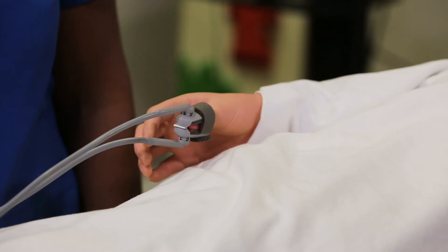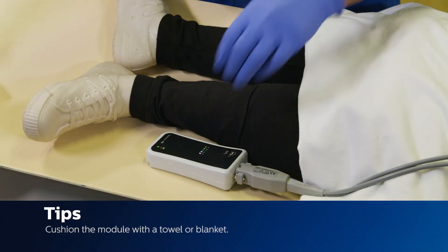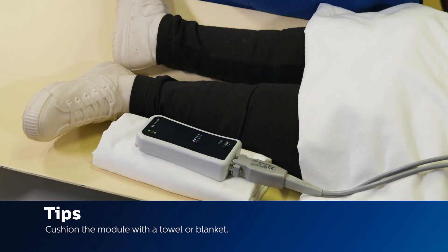To ensure SPO2 accuracy, make sure the probe is applied to the patient correctly. Tip: Place the module on a cushioned surface, such as a blanket or towel, to minimize MR scanner vibrations.